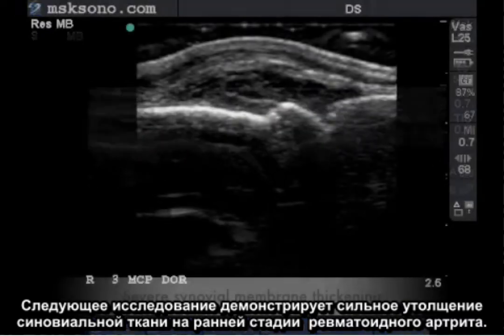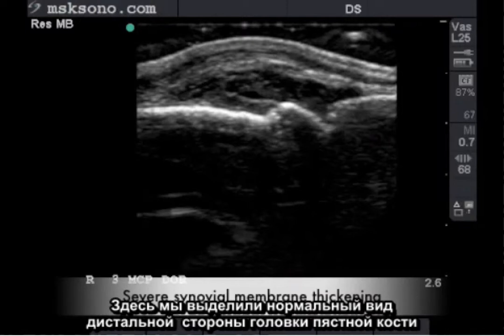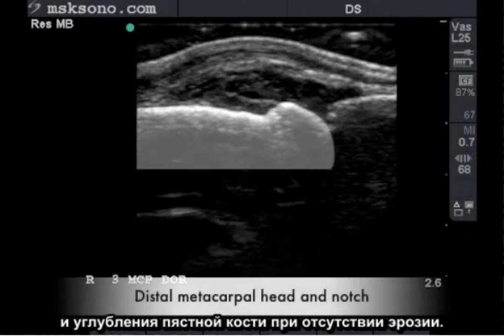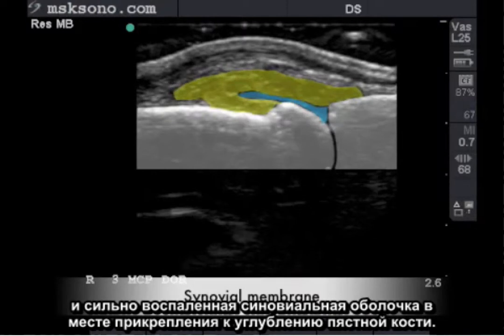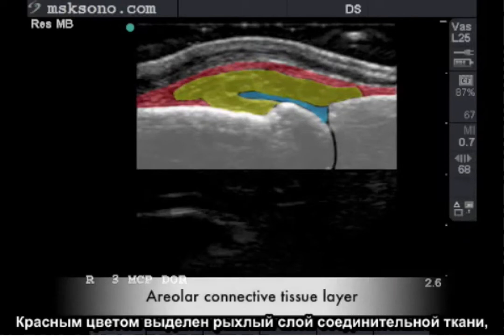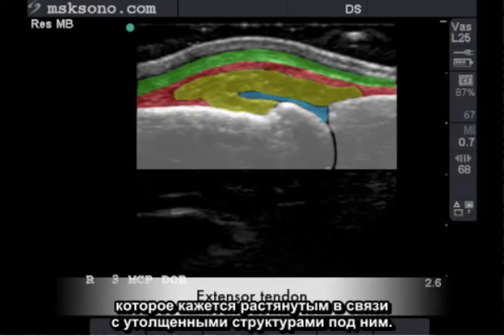The following study demonstrates severe synovial thickening in early rheumatoid arthritis. Here we have highlighted the normal appearing distal metacarpal head and metacarpal notch with no erosion. Here is the proximal phalanx, followed by the normal amount of physiologic fluid, and our severely inflamed synovial membrane as it inserts into the metacarpal notch. Highlighted in red is the areolar connective tissue layer, followed by the common extensor tendon, which appears distended due to the thickened structures beneath it.